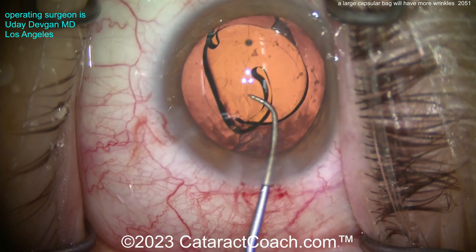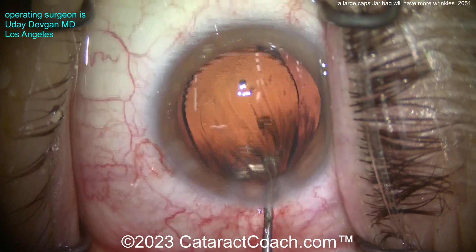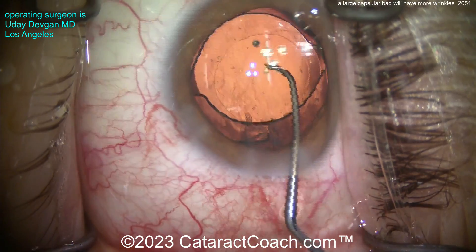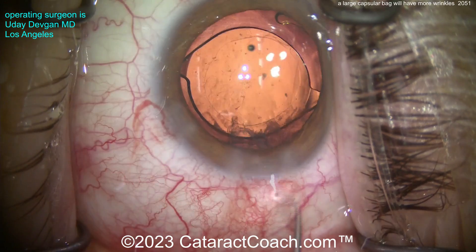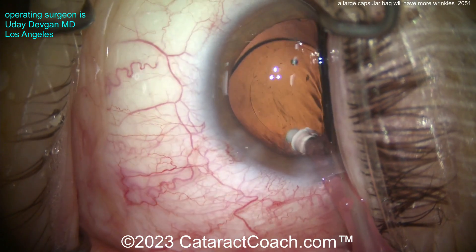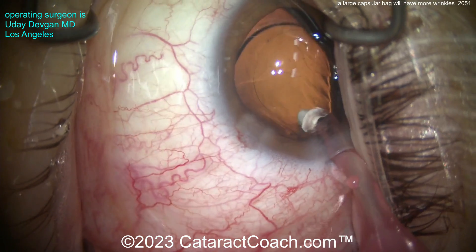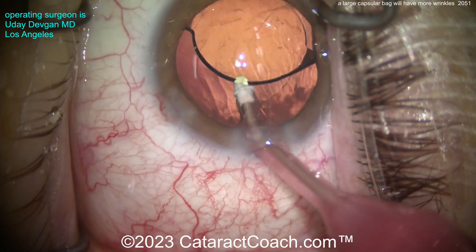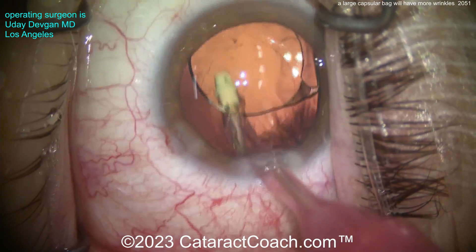With a one-piece lens you don't have that extreme outward force of the haptics from the three-piece lens — it's a lot more forgiving and won't put as much outward pushing pressure on the capsular bag equator. There is a little bit of sub-incisional cortex, so I'm using that haptic-optic junction to rub and loosen it up. Now I'll get the I/A probe in the eye to aspirate that out. The I/A can loosen it as you move it around, and also acts as a barrier to keep the posterior capsule at bay as you remove that last bit of lens cortical material.